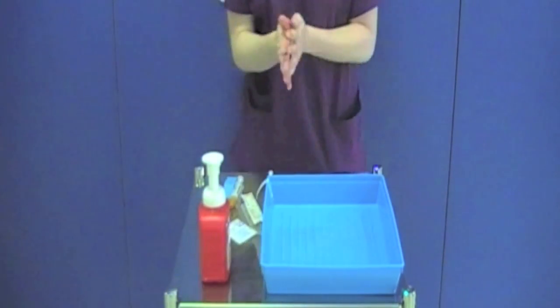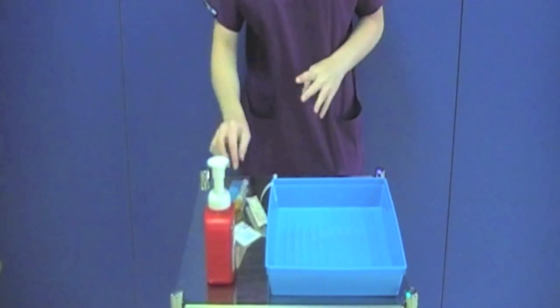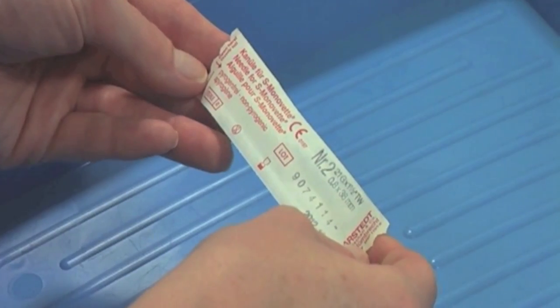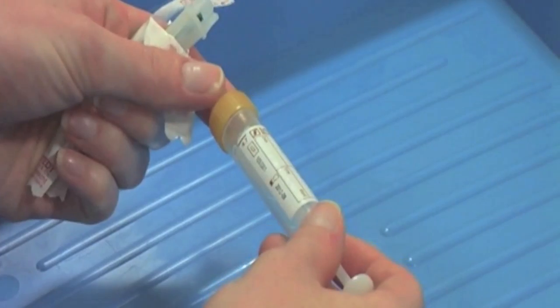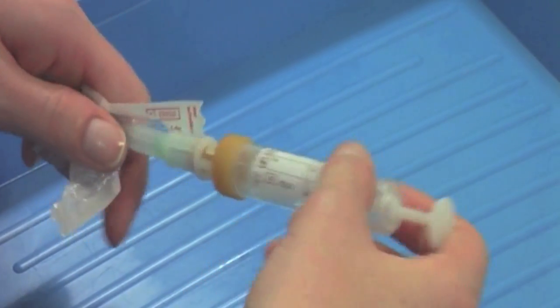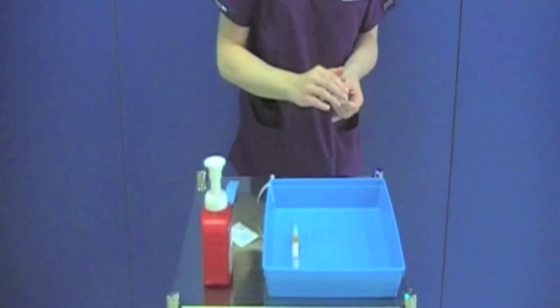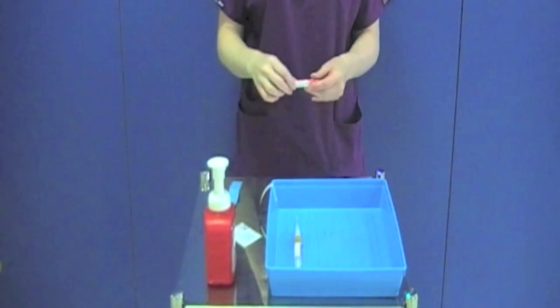You must now decontaminate your hands. Check that all of your equipment is in date. Remove the needle from its outer packaging and attach it to the first blood sample bottle. As the key parts are still protected, you can place the bottle and the needle into your tray along with the rest of your equipment.